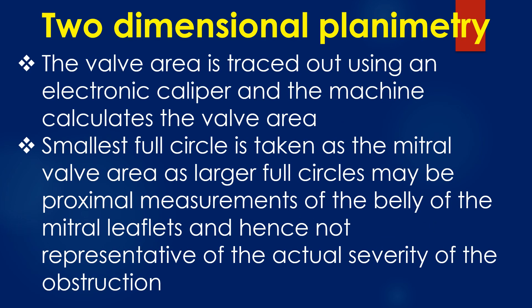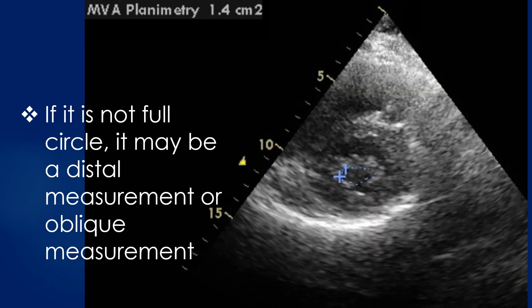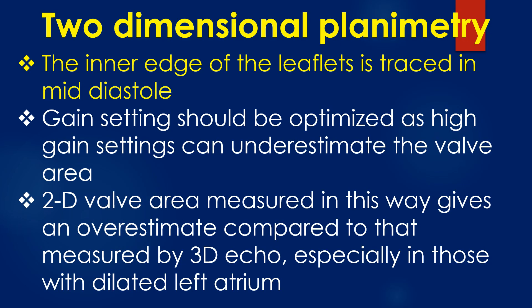In two-dimensional planimetry, the valve area is traced out using an electronic caliper and the machine calculates the valve area. The smallest full circle is taken as the mitral valve area, as larger full circles may represent proximal measurements of the belly of the mitral leaflets and are not representative of the actual severity of obstruction. If it is not a full circle, it may be a distal or oblique measurement. Mitral valve area by planimetry is usually obtained from the parasternal short axis view, and can also be obtained from the basal transgastric short axis view by transesophageal echocardiography. The inner edge of the leaflets is traced in mid-diastole, and gain settings should be optimised, as high gain settings can underestimate the valve area.